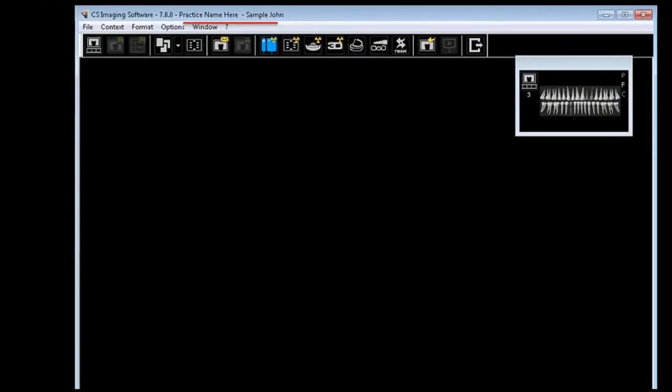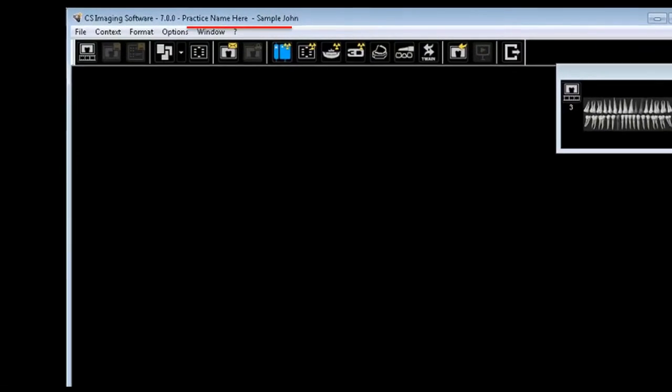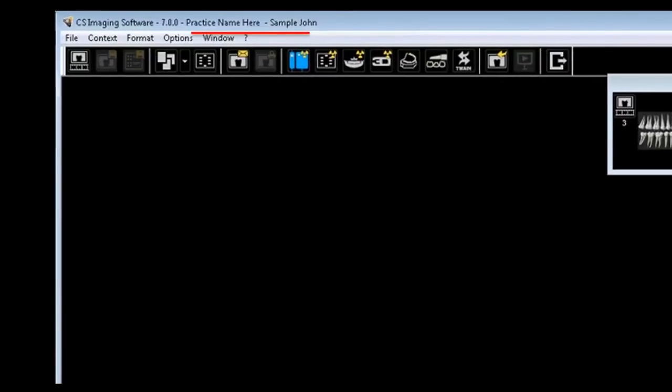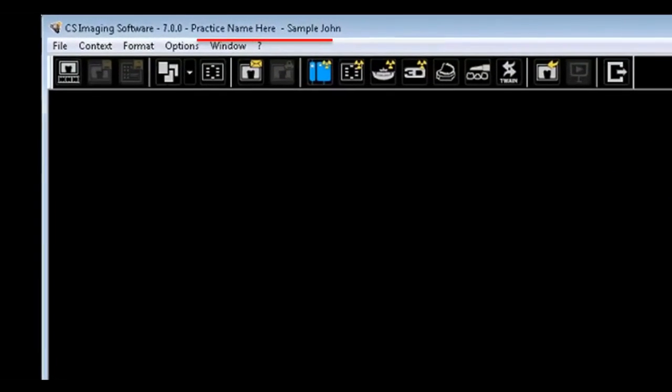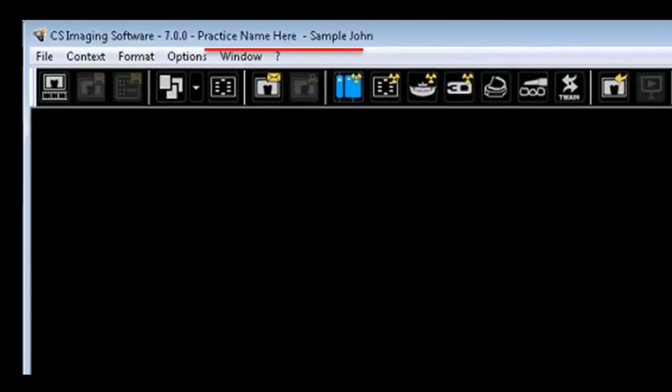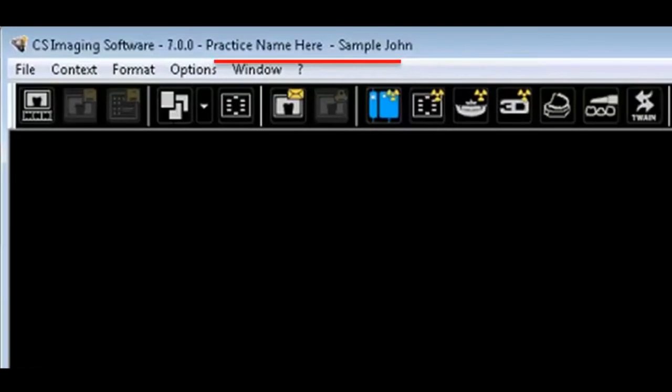The next thing you want to do upon entering a patient's imaging file is to verify the name of the patient is correct. This is also displayed along the top of the screen.